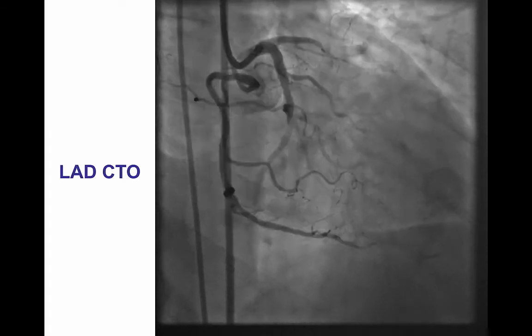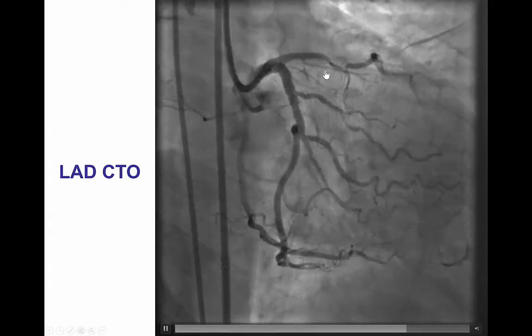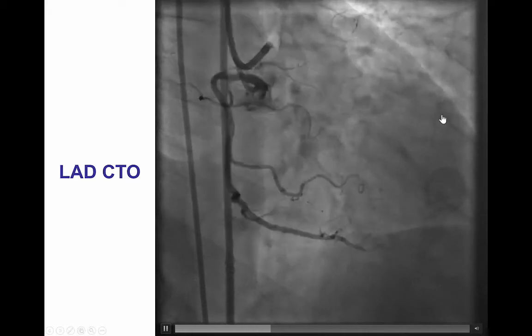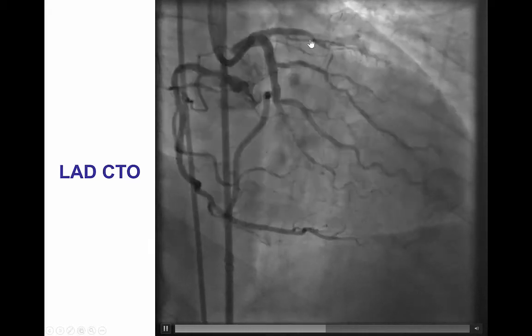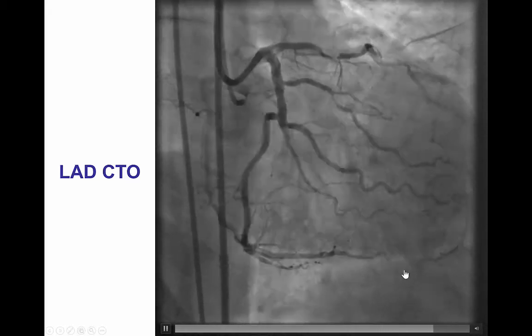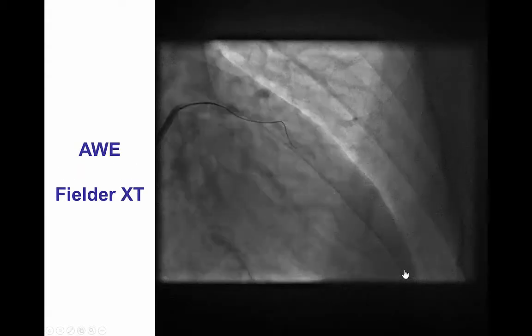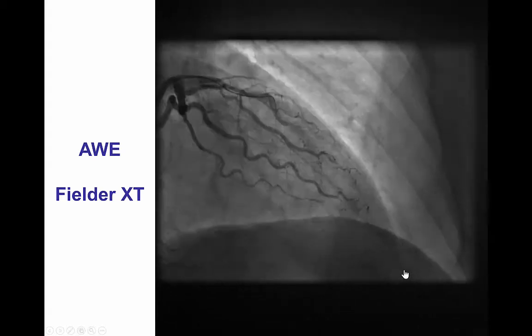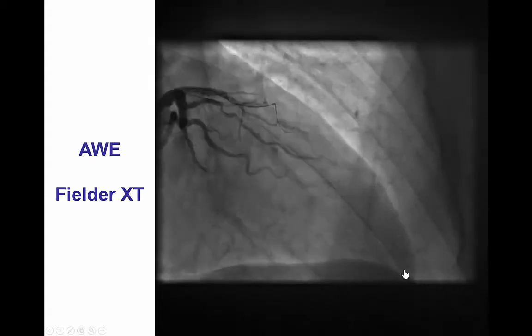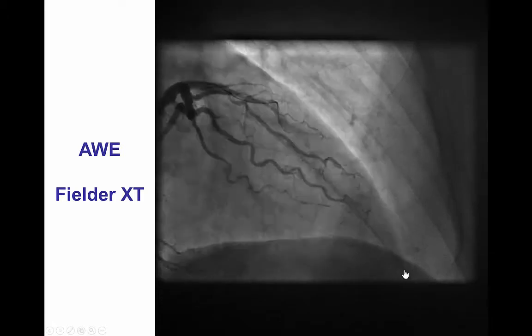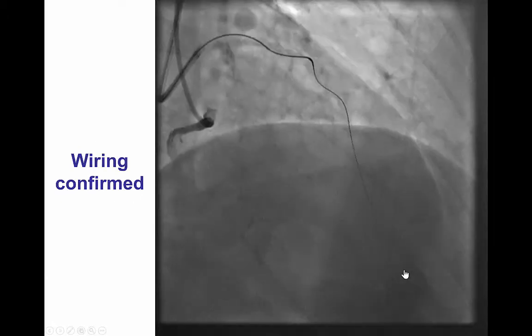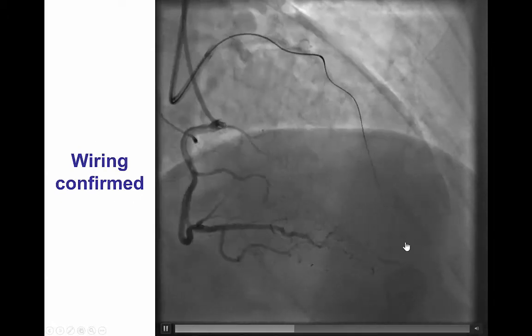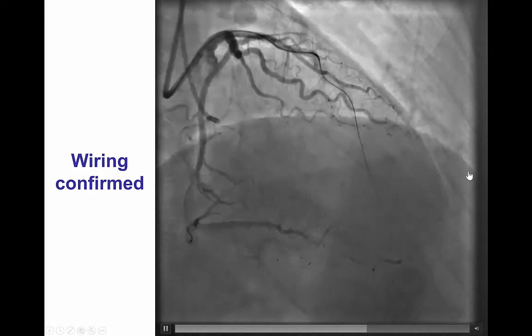The patient presented with a mid-LAD CTO. This was a heavily calcified vessel with significant tortuosity as well. However, crossing was fairly easy. It was achieved with antegrade wire escalation using a Fielder XT guide wire that was advanced to the distal LAD, as confirmed with contralateral injection.